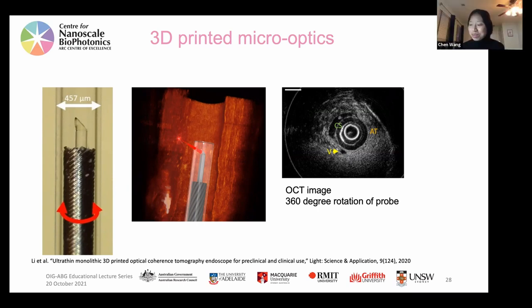I have several questions. So awesome. Thank you for your beautiful talk. It's exciting to see your team and your collaborators bridging optics and brain diagnosis. My question is, I'm interested in the penetration limitation. Is it possible to use longer fiber plus micro optics to push the limitation?